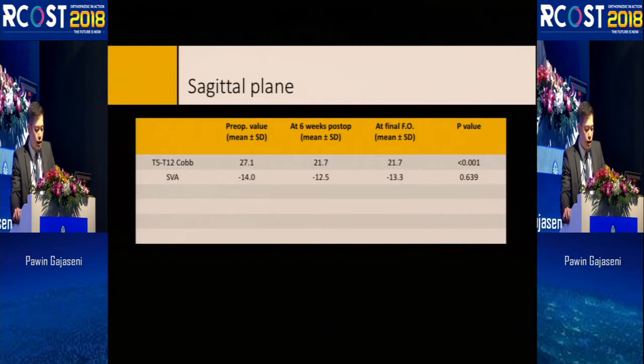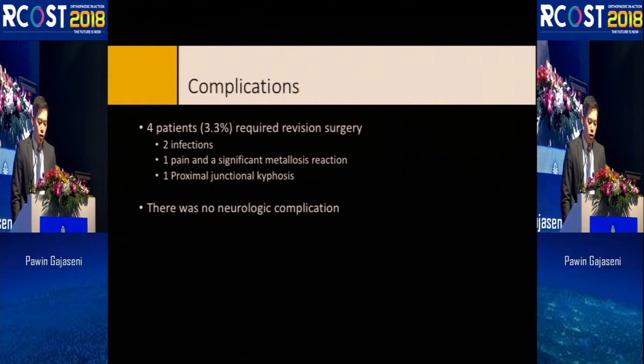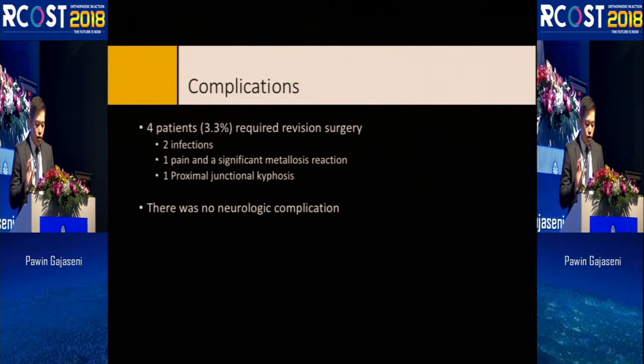In the sagittal plane, the T5 to T12 curve went from 27 to 21 degrees, and the SVA from minus 14 to minus 13. For complications, we found that 3.3% required revision surgery: 2 because of infection, 1 because of pain and significant metallosis reaction, and 1 for PJK. There was no neurologic event with this technique.